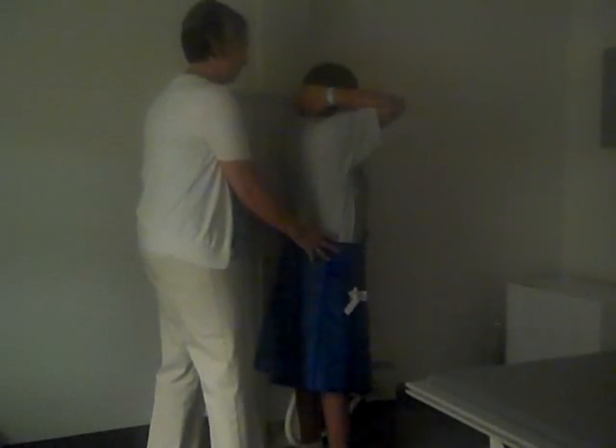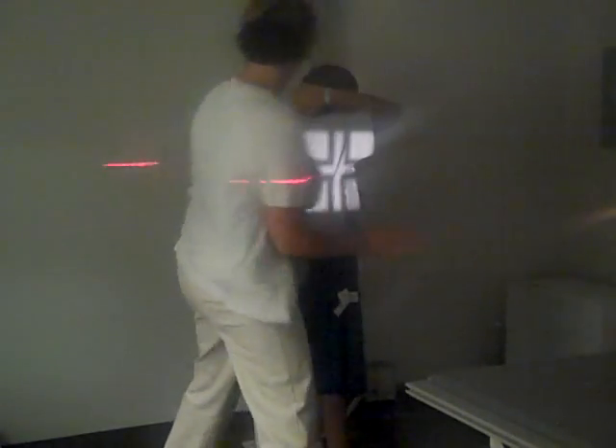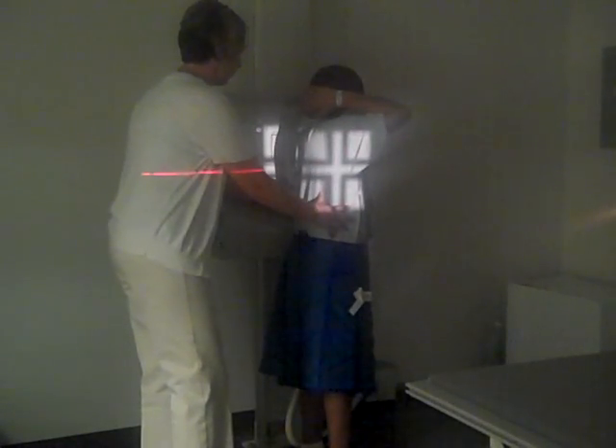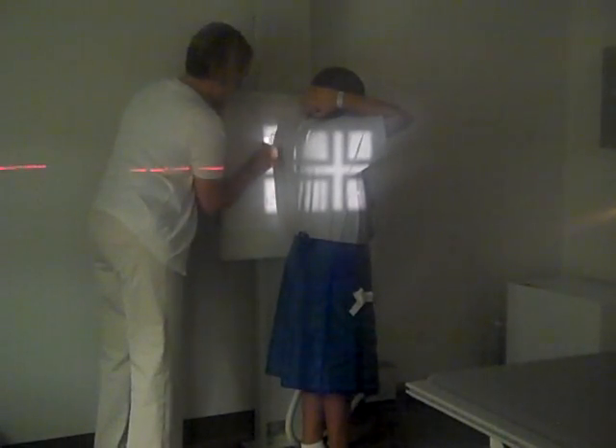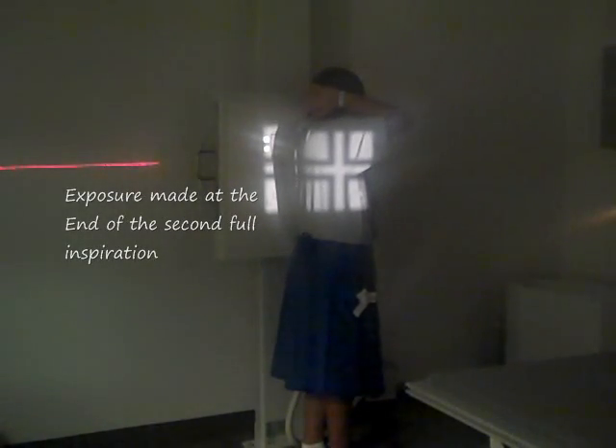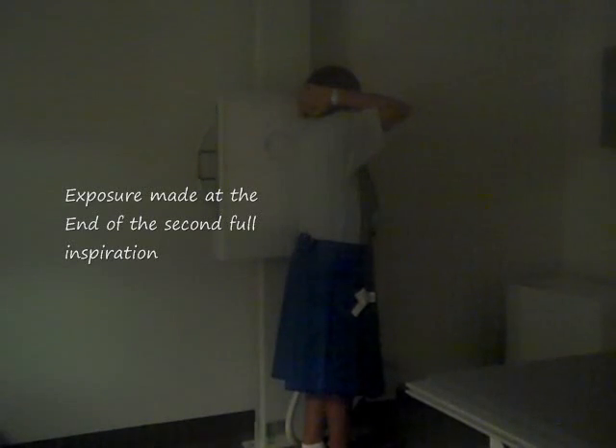Hold real still right there. Don't want to lose my marker. I'm going to step out of the room and have my patient take a big deep breath in. Blow your breath out. Take another big deep breath in. Hold your breath in. Don't move. Good. You may relax.